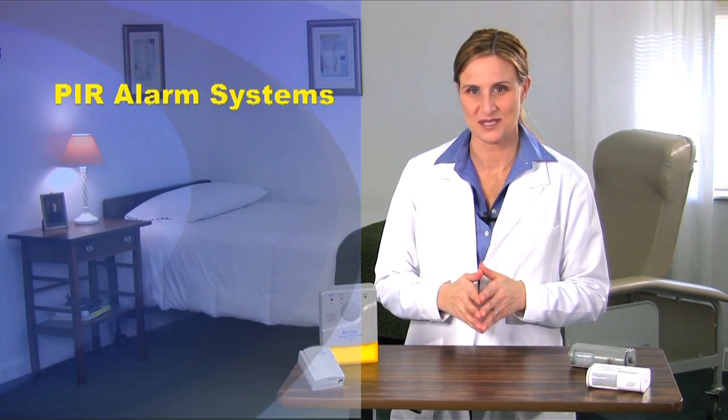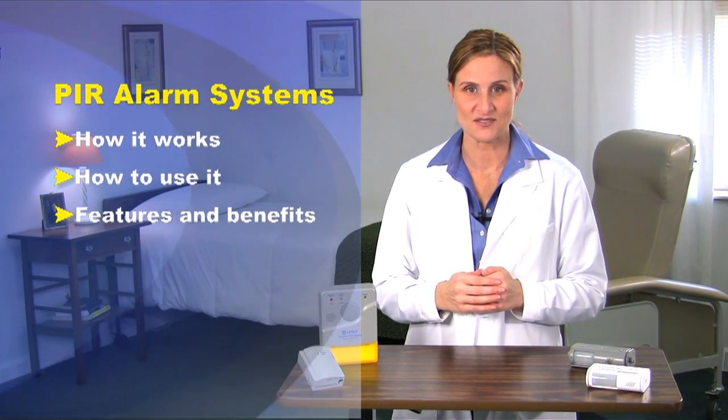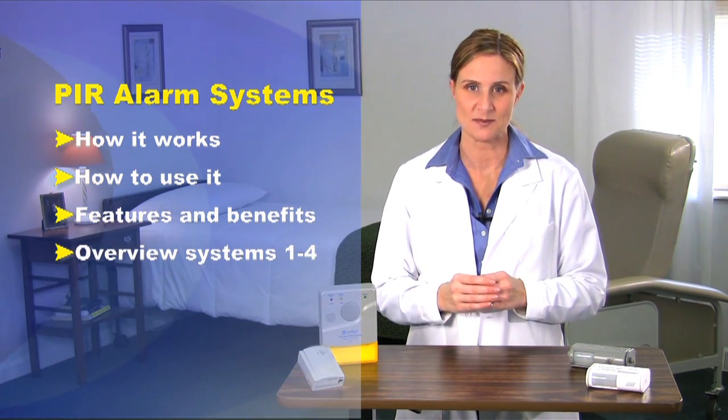Join me now for an overview of the PIR fall alarm systems. The overview will explain how it works, how to use it, all the features and benefits of the system, and we'll overview the four other available PIR system variations.